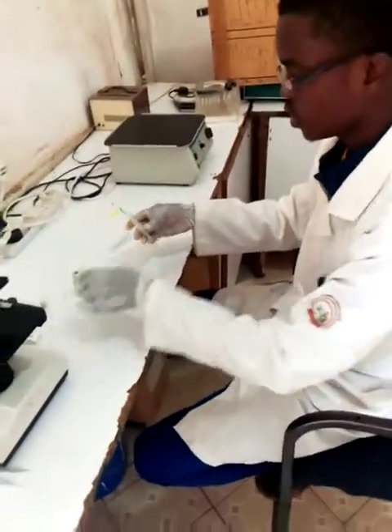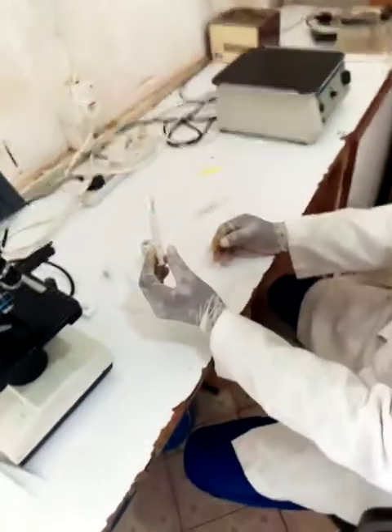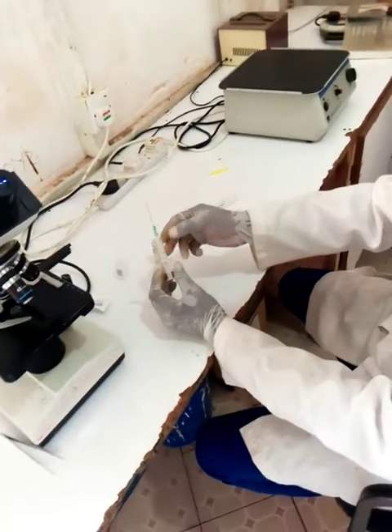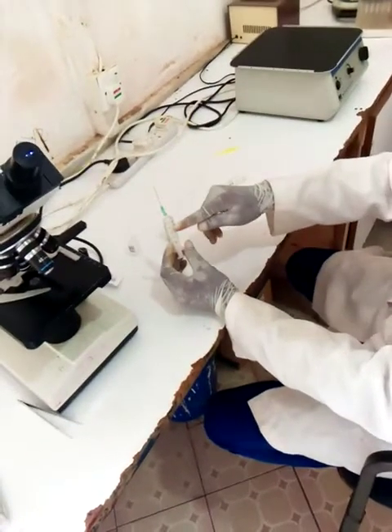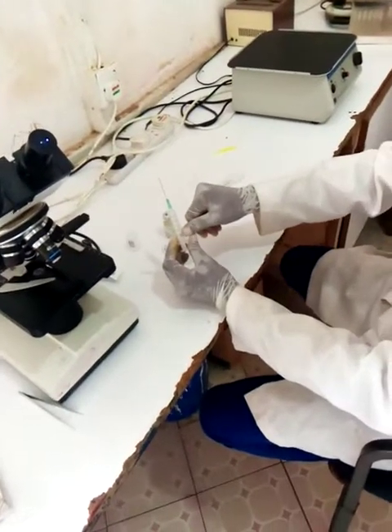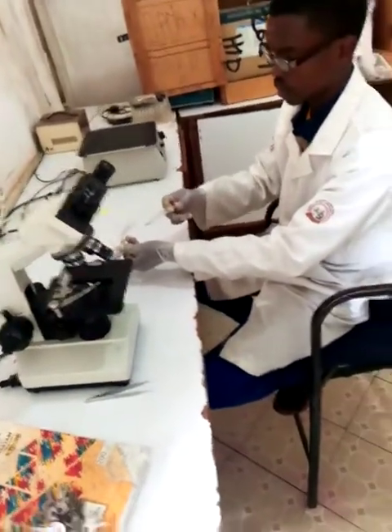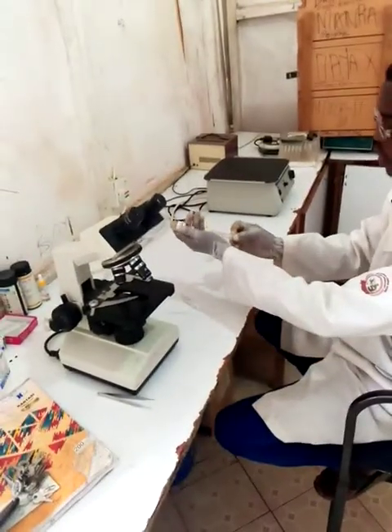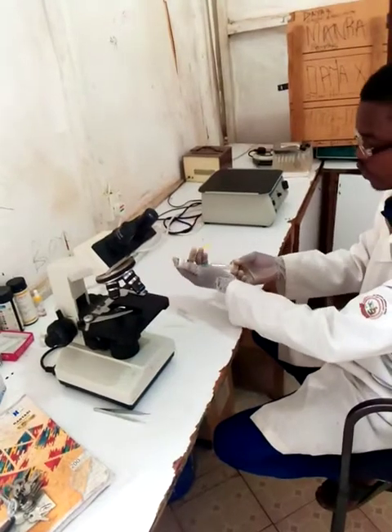Let us see it now. This syringe contains 1, 2, 3, 4, and 5 ml. So 1ml is 100mg, 2ml is 200mg, 3ml is 300mg, 4ml is 400mg, and 5ml is 500mg. Then I draw up 5ml in the syringe.